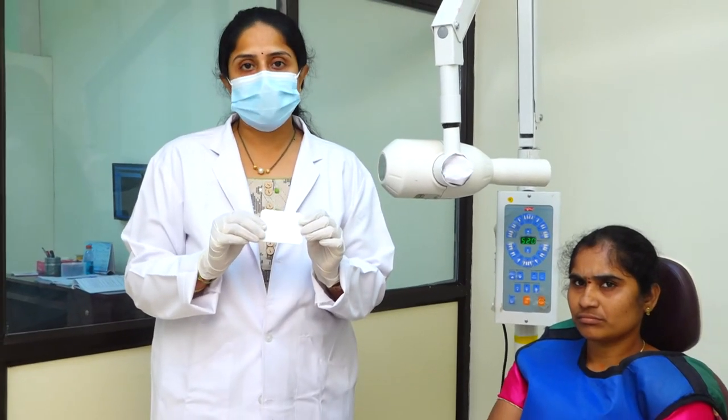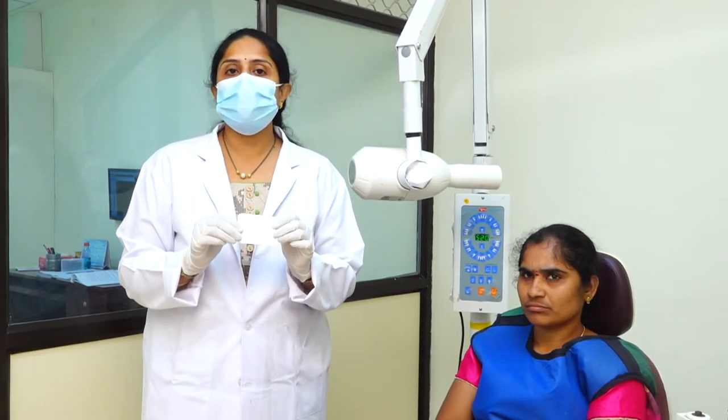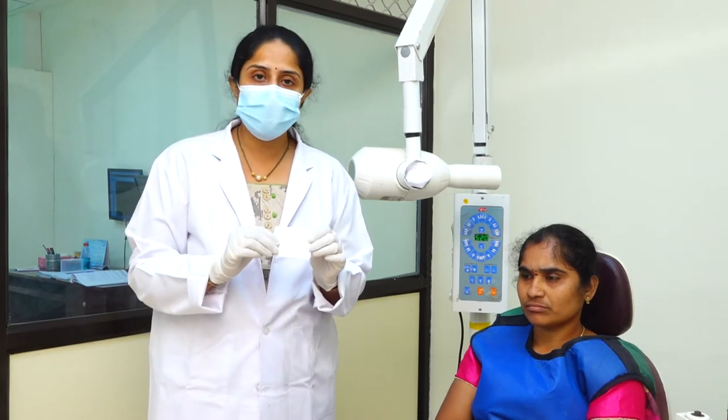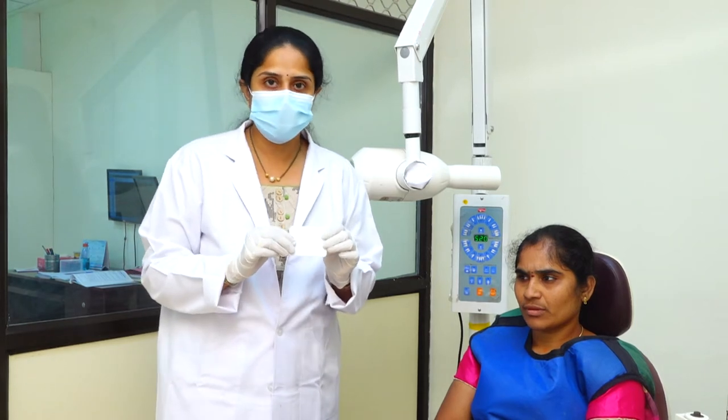For the mandible also the same — mandibular anterior, mandibular cross-sectional, and the mandibular lateral radiograph. Let's have a demo on the patient. I will show all the types of the occlusal radiograph on the patient.